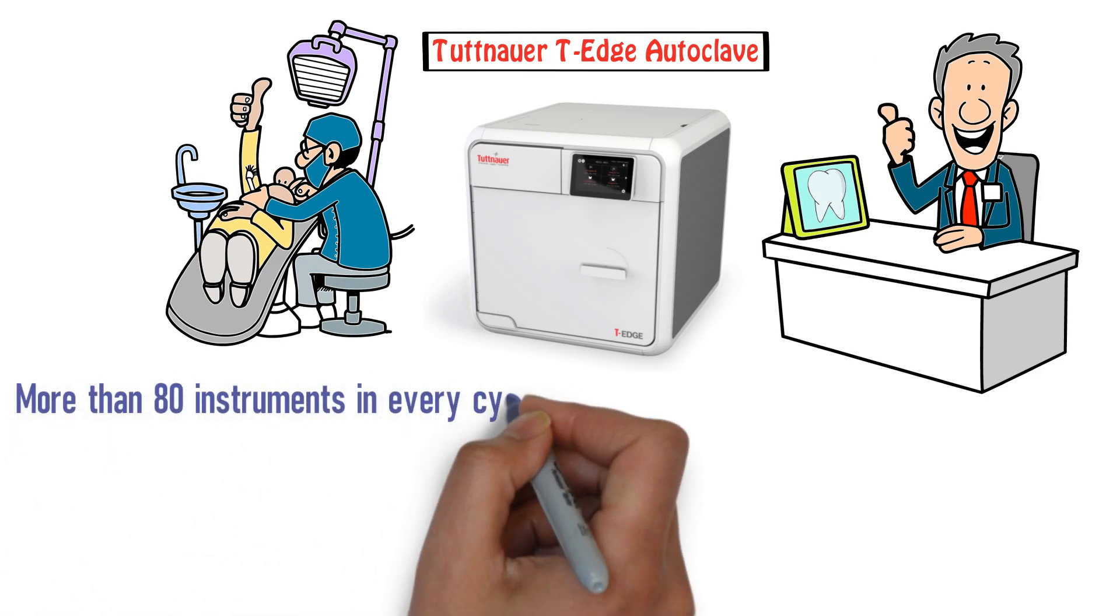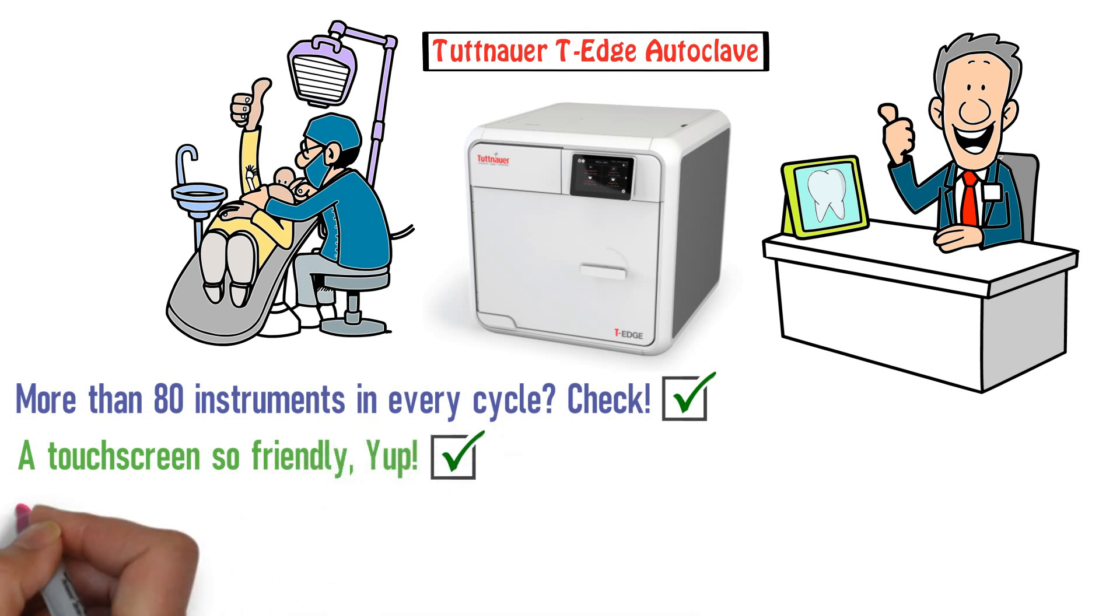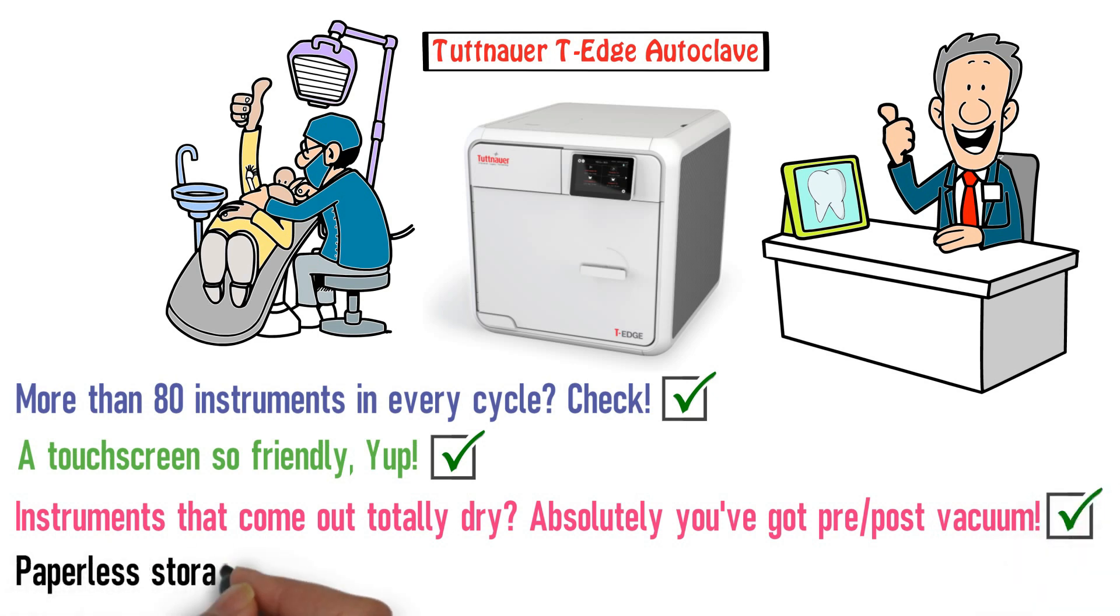More than 80 instruments in every cycle? Check. A touch screen so friendly? Yep. Instruments that come out totally dry? Absolutely. You've got pre-post-vacuum. Paperless storage? Check.